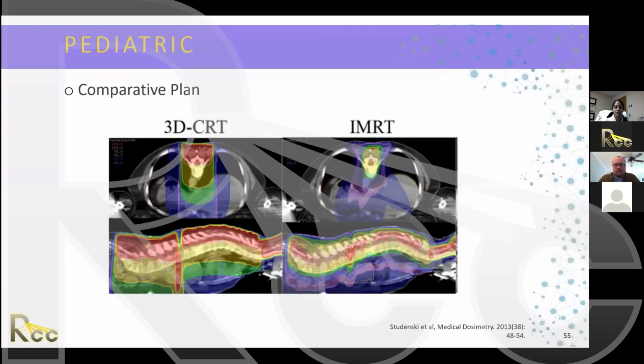Granted, especially when you're doing head and neck cases, for instance, where you go to quite a high dose overall for concurrent chemo RT, and you might give concurrent cisplatin, that makes the situation a little complicated. So you want to go as low as you can potentially get it. At least with my VMAT plans, we are able to meet the constraints, and generally I shoot for a mean of less than 20, though depending on the scenario, I might have to accept a little more.